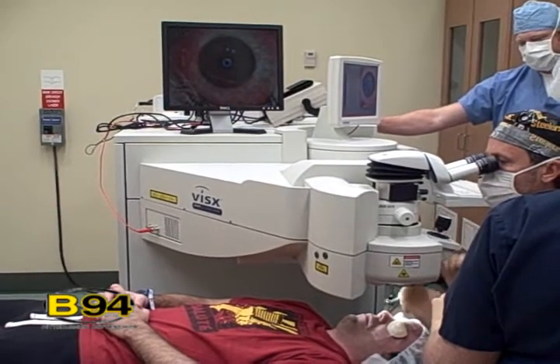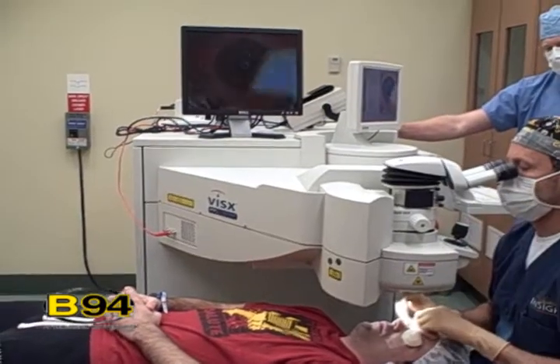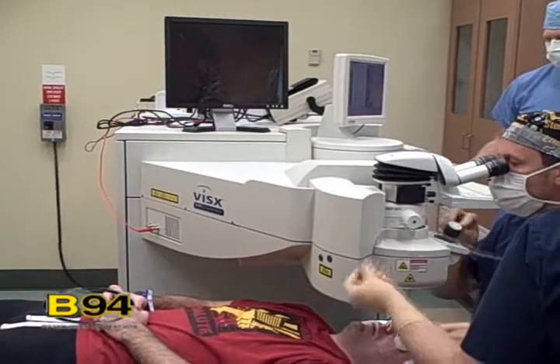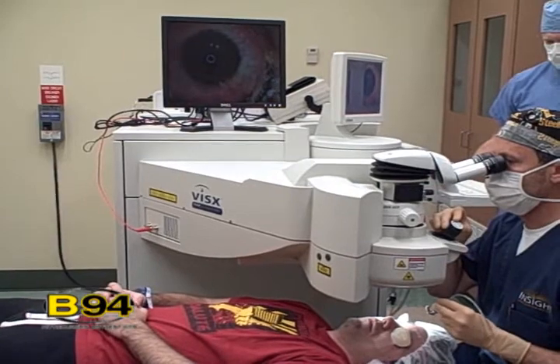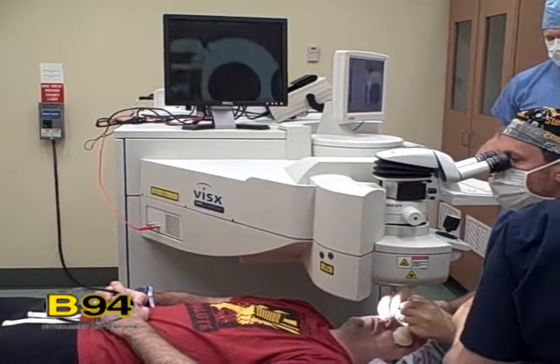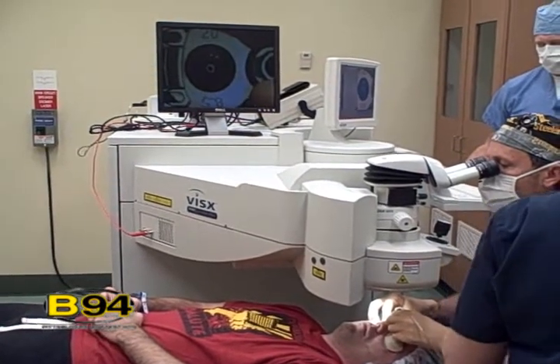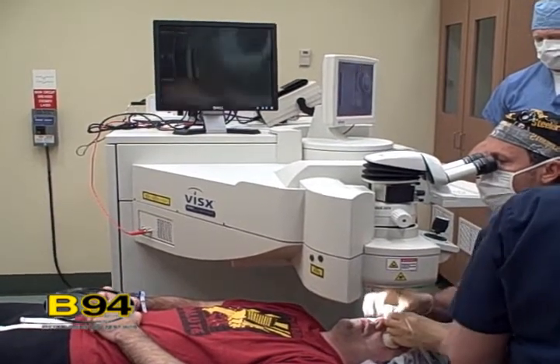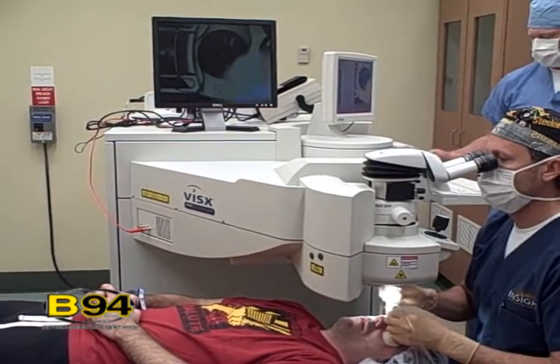The only reason we make a flap in LASIK is for your comfort and speed of visual recovery, because I can do the same thing on the surface — which is what the laser was originally approved for — but I have to make a big scratch on your eye to do that, and no one likes going through that scratch. It's uncomfortable, your eye burns and waters. So the LASIK flap makes things much more comfortable. We'll make the flap, then apply the laser to reshape the surface, make things a little flatter, and correct your vision. It does it exquisitely accurately.